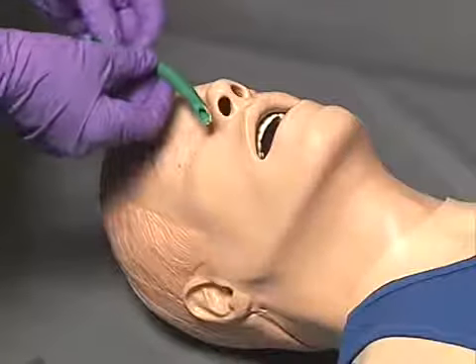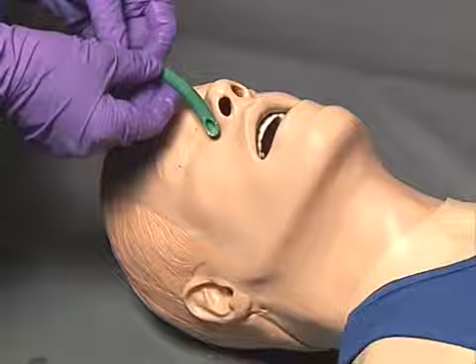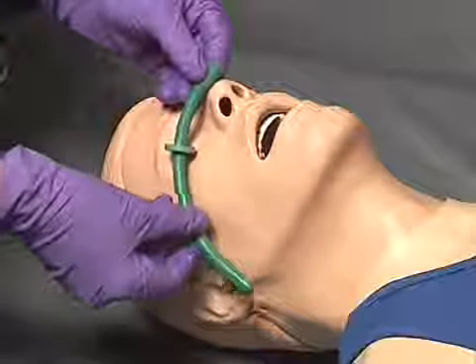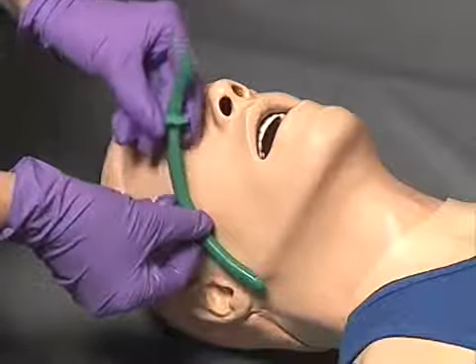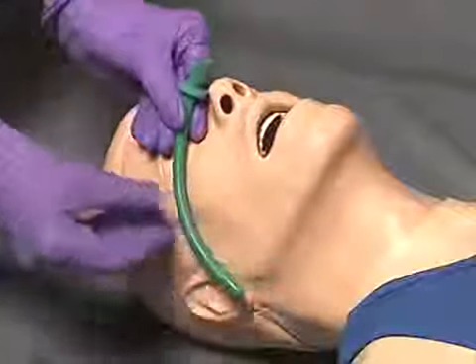To select the correct size nasal airway, begin by visualizing the patient's nares and select a nasal airway with a diameter slightly smaller than the patient's largest nare. Once the diameter is determined, then measure the device from the tip of the patient's nose to the tip of the earlobe or angle of the jaw. The rubber washer or grommet can be slid back and forth on the device to ensure a proper fit.